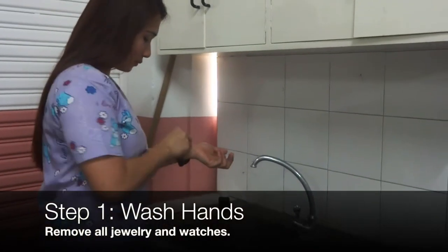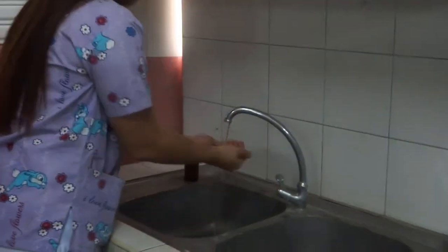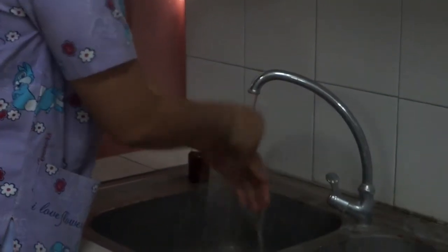Step one: Wash hands. Be sure to remove all jewelry and watches. This is to prevent spreading any harmful microorganisms.